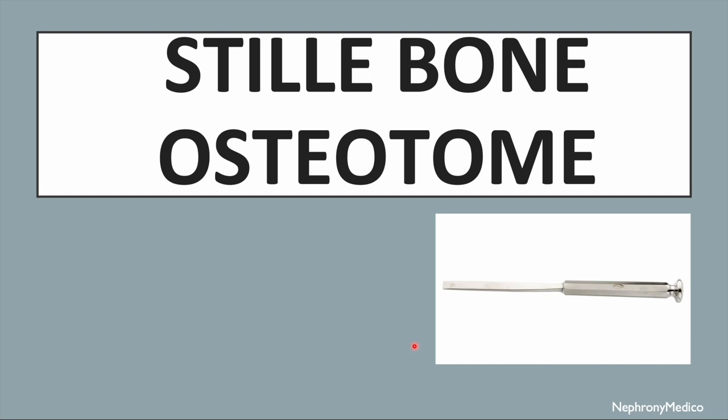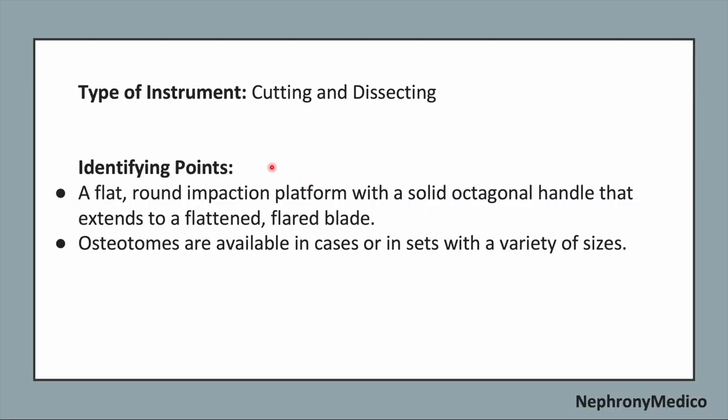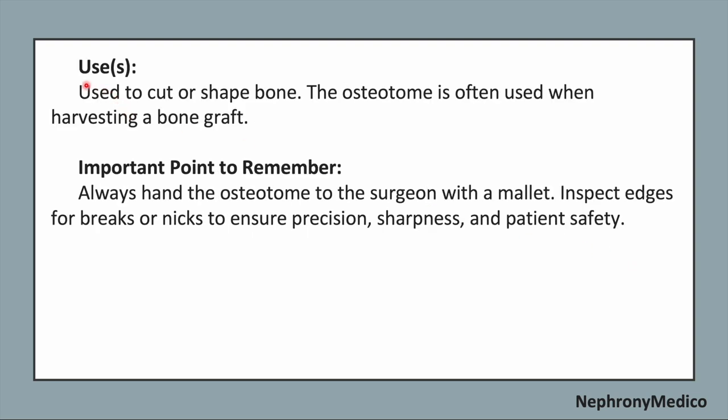Let's talk about the Stille bone osteotome. This is a picture showing a Stille bone osteotome. Now, it is a cutting and dissecting type of instrument. Identifying points: a flat round impaction platform with a solid octagonal handle that extends to a flattened flared blade. The osteotomes are available in cases or in sets with a variety of sizes. Use: it is used to cut or shape bone, and the osteotome is often used when harvesting a bone graft.